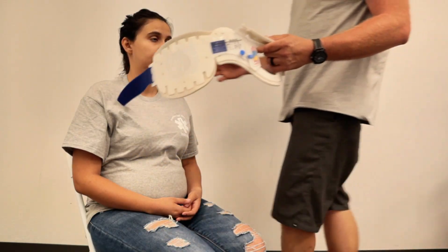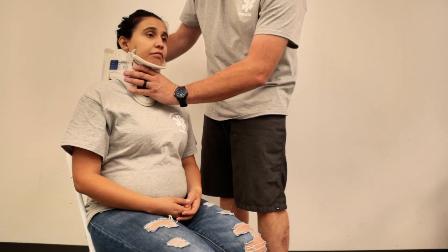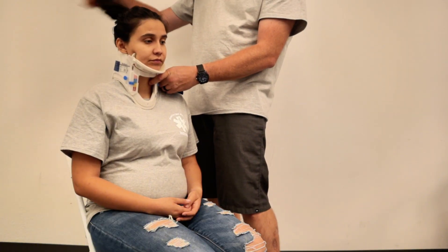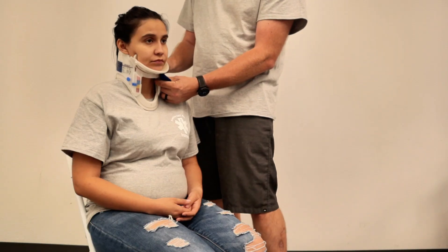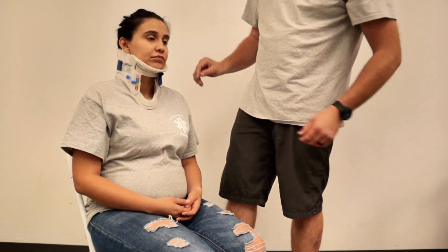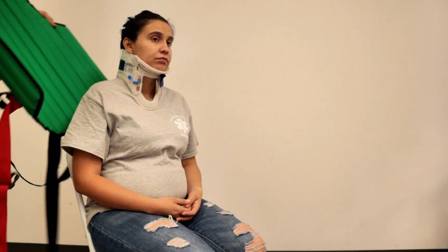Now we can put on a C-collar. The best way is we start with the chin after measuring appropriately — this is the correct size for her. If it ever seems a little different, you can always undo it and adjust it slightly. We still have somebody stabilizing the spine here. We'll grab our device — it comes mostly in one piece, and there are just a couple of pieces that we will apply later.